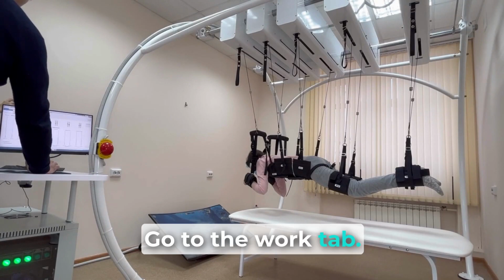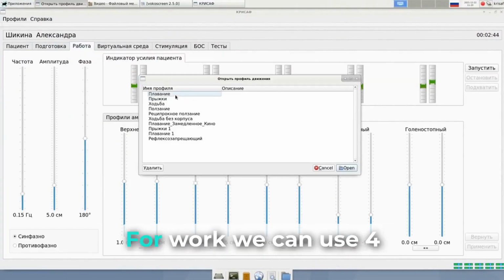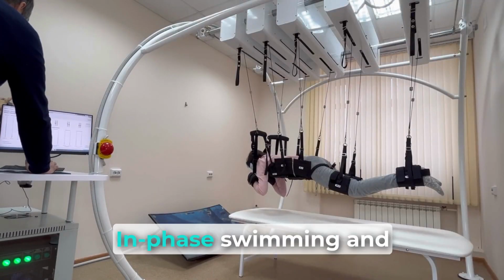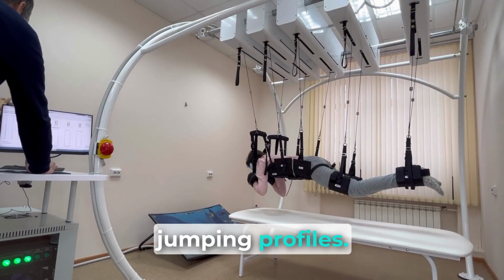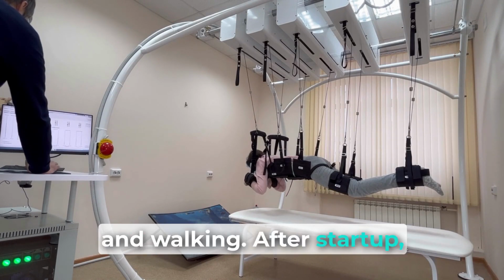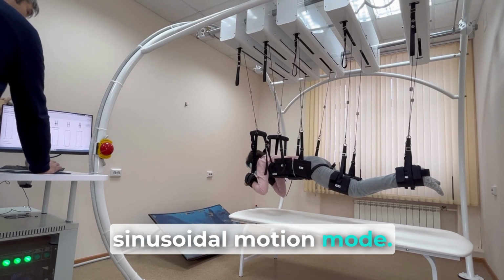Go to the Work tab. Using the motion profile, select Swimming. We apply. For work, we can use 4 standard profiles. In-phase swimming and jumping profiles. Anti-phase profiles of crawling and walking. After startup, all actuators operate in forced sinusoidal motion mode.